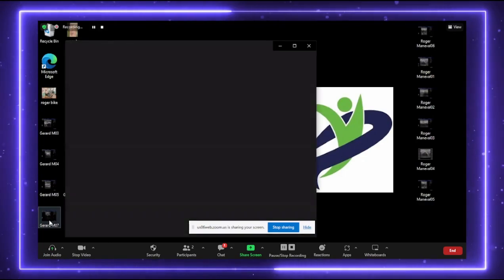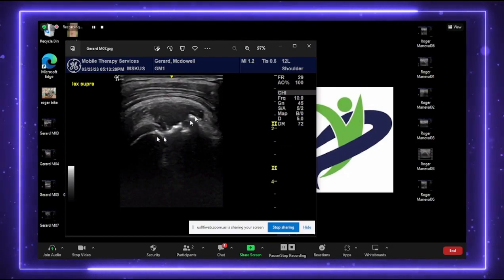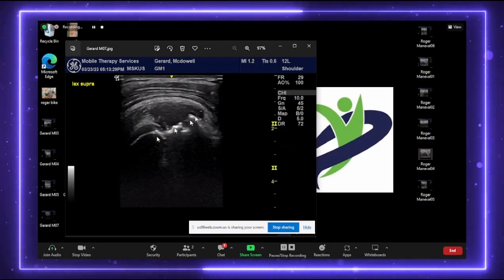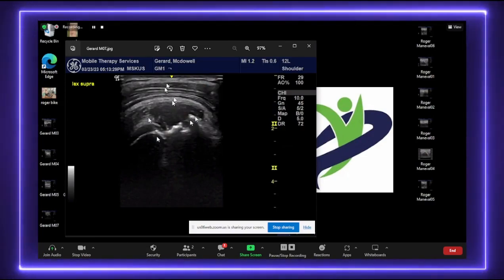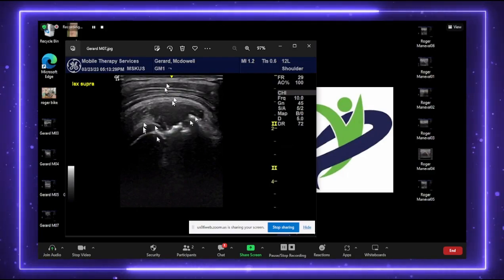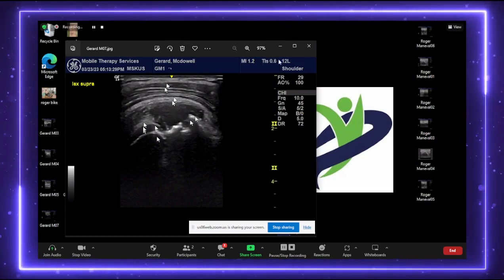We're going to come into his supraspinatus. This picture really says a lot. So, as Dr. Jacobson pointed out, cortical irregularity along the greater tuberosity is not a good positive sign of an intact cuff. We have his overlying anterior deltoid. We have his thickened subacromial subdeltoid bursa. We have a little bit of a cartilage interface sign here with fluid underneath, some part of a tendon, and there's really no tendon fibers coming across into the greater tuberosity.